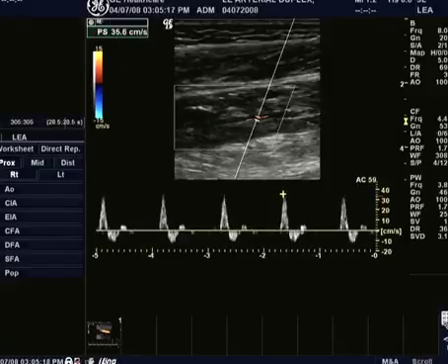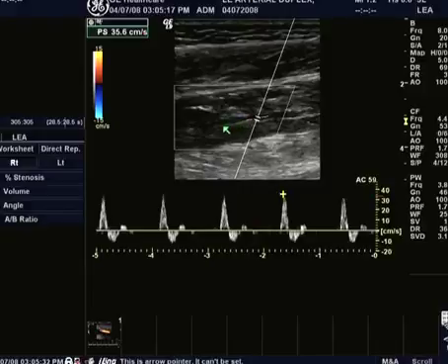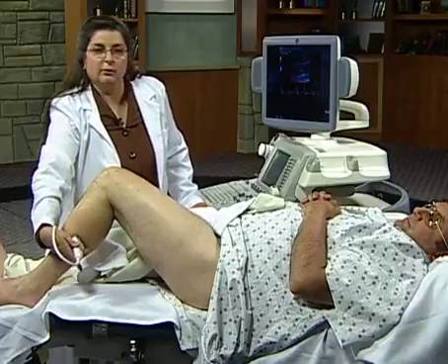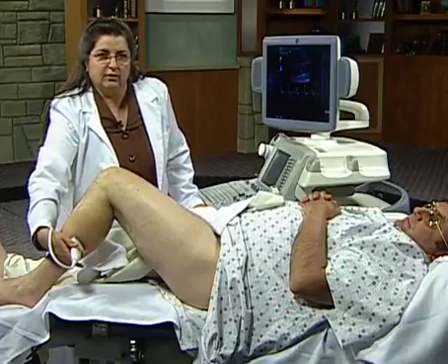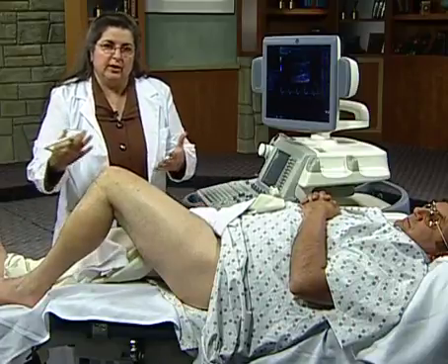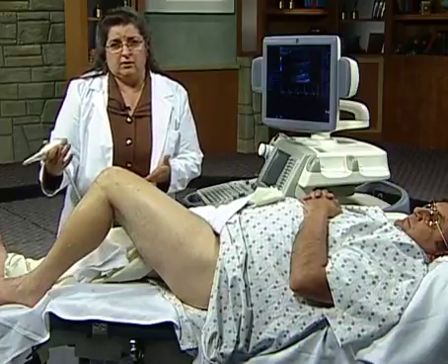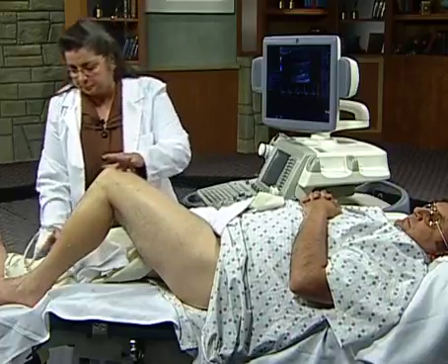And we can see still yet, even in this very small, relatively distal calf artery, we still see that triphasic waveform. And we can appreciate here, again, the various phases, the vessel up here, nice and healthy, companion veins over here. And typically the approach that I use, coming around pretty much lateral yet posterior, is what we want to be able to evaluate these peroneal vessels. And we'll follow this up to where it comes in to the posterior tibial artery, and that will really complete the assessment of the peroneal arteries and the posterior tibial arteries.